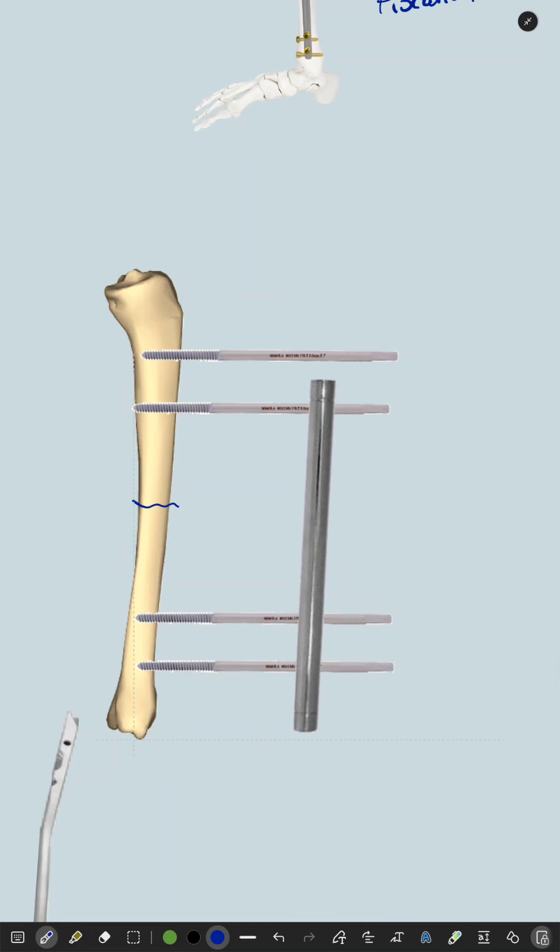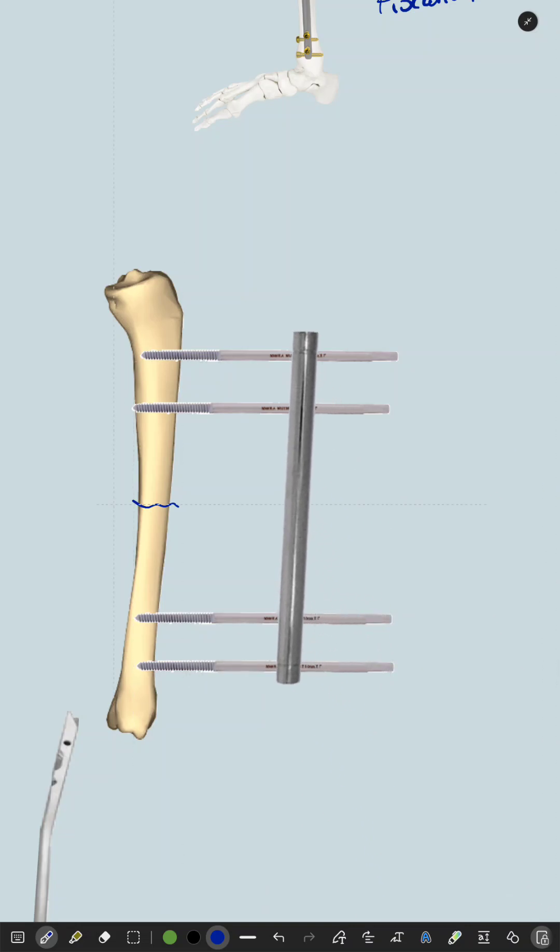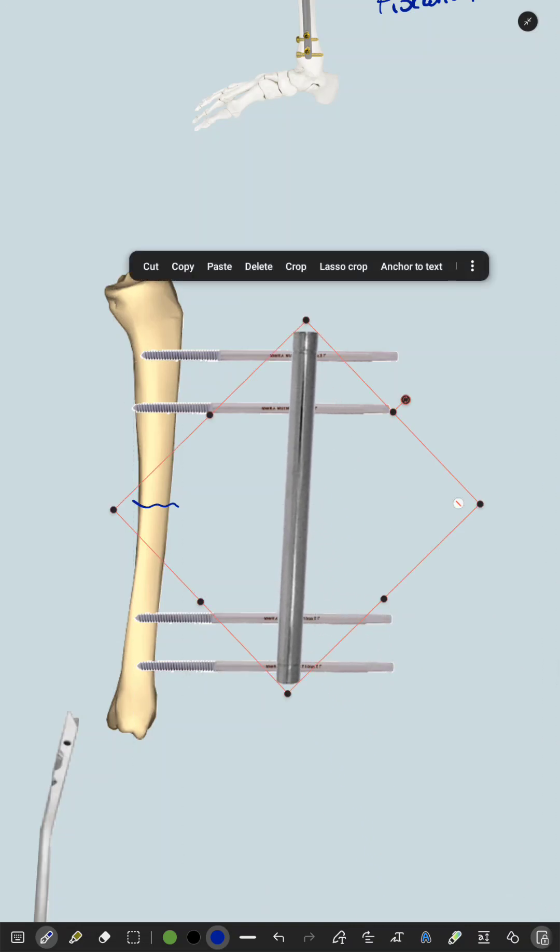Then we fix a rod across these Schanz pins using certain clamps called AO clamps.